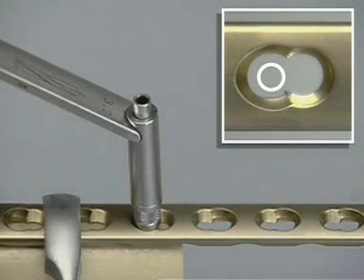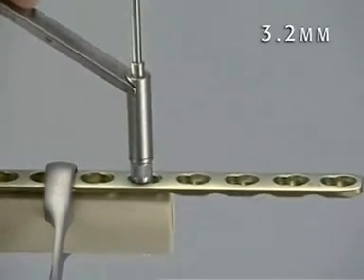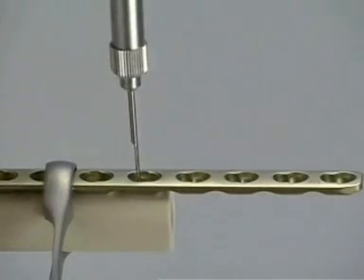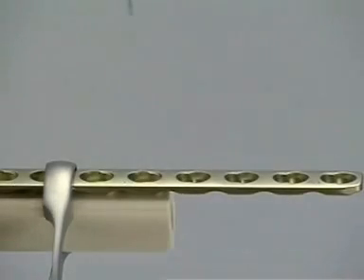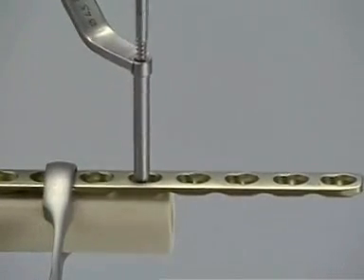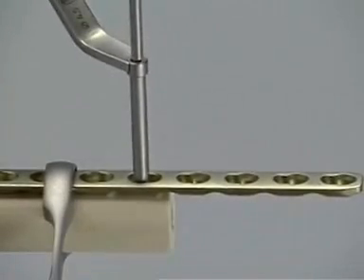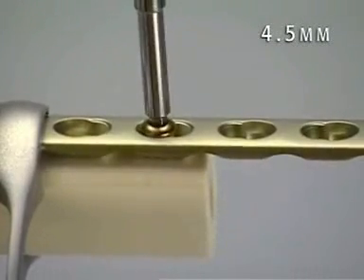The spring-loaded insert now protrudes from the outer sleeve. With the drill guide in the neutral position, a 3.2 mm hole is drilled through both cortices. The depth gauge is used to determine the required length. The thread is cut in both cortices with the 4.5 mm tap, with the soft tissues and the plate surface protected with the appropriate protection sleeve. A 4.5 mm cortex screw is inserted and tightened.